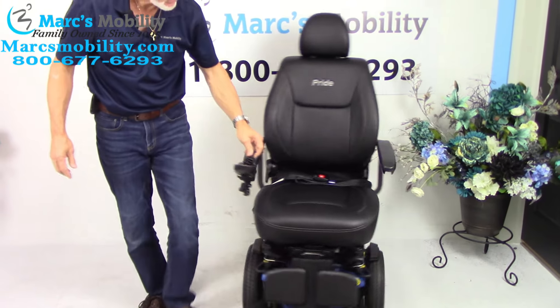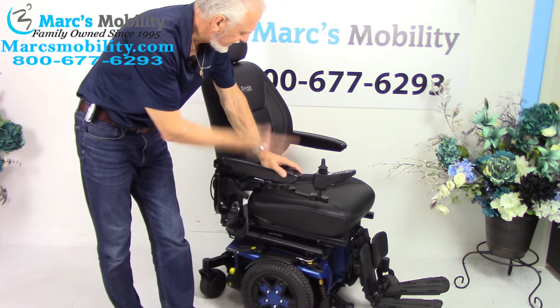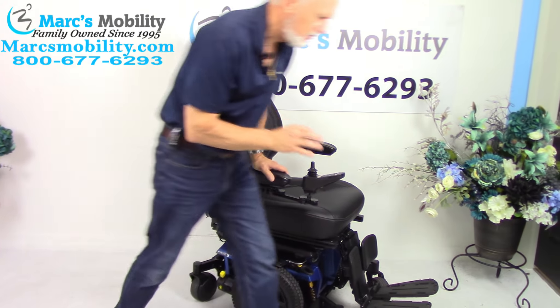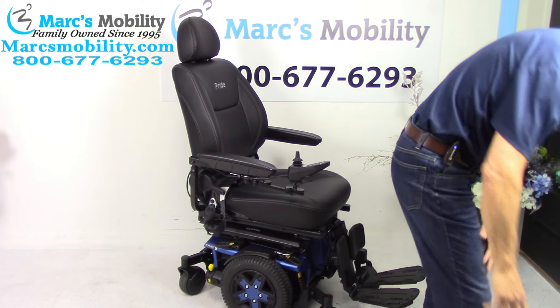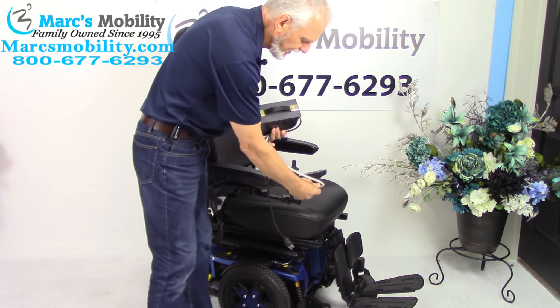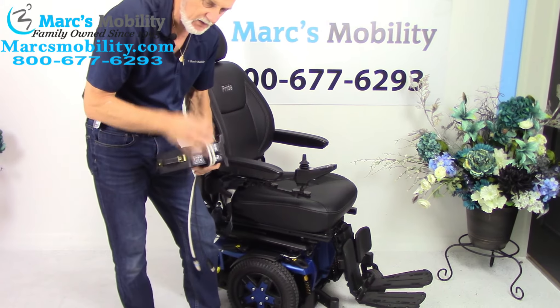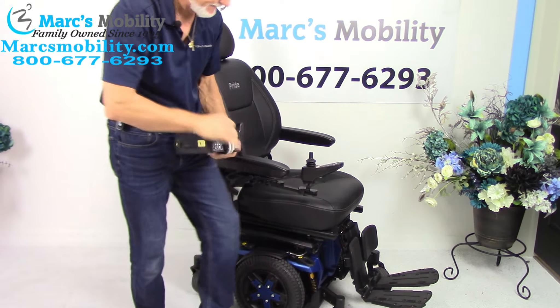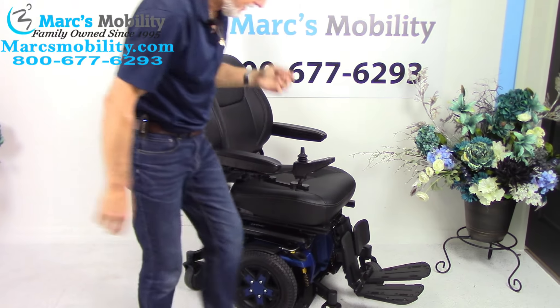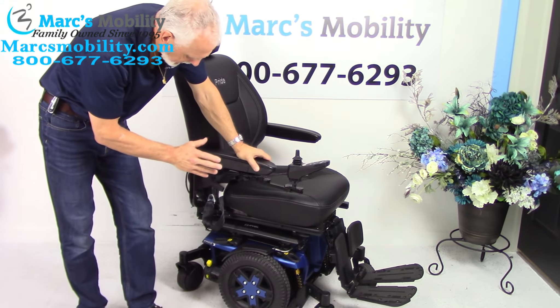The back is also a manual recline. The only electric functions on this chair are the electric seat lift and the drive motors. To charge the chair, you plug the charger in below the joystick. When the light goes from orange to green, you're fully charged.